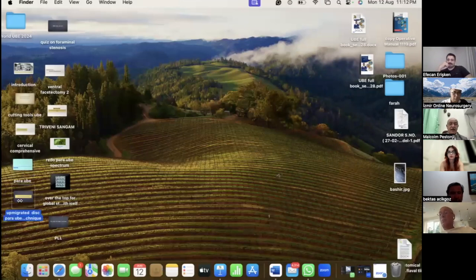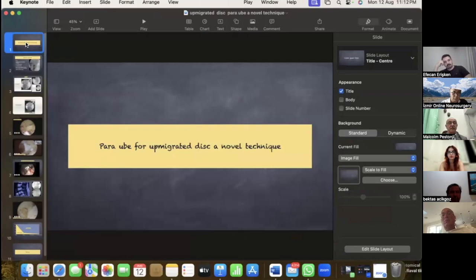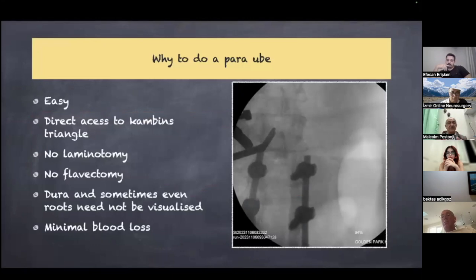Now we talk of para-UBE for up-migrated discs. I have published on this, and this paper is also coming up in the next issue, so you will enjoy that. But right now you can see this video. Can you see what I've done?